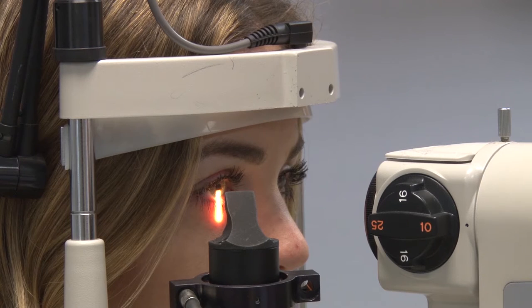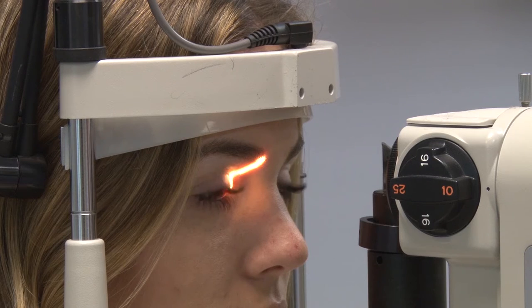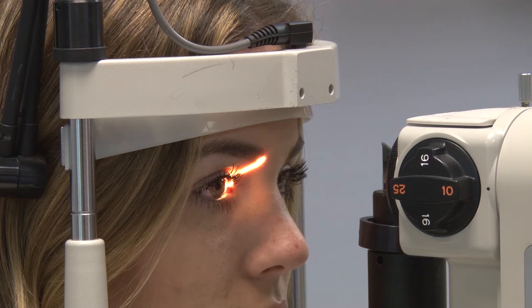I'm coming across and I've reached the midpoint of her eye. I'm going to move the light source to the nasal side and continue my sweep all the way to the inner canthus. When I get to the inner canthus, I'm going to raise the beam up so it's as high on the upper lid as it was low on the lower lid. The goal is to try and keep it out of her pupil until we have to enter the pupil as we sweep the cornea.